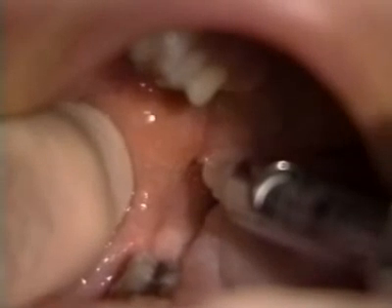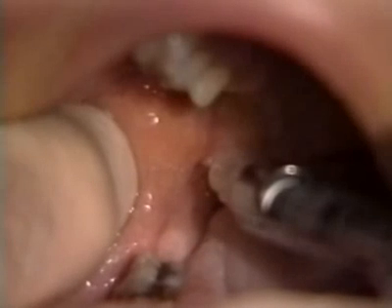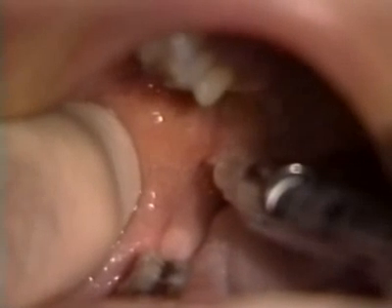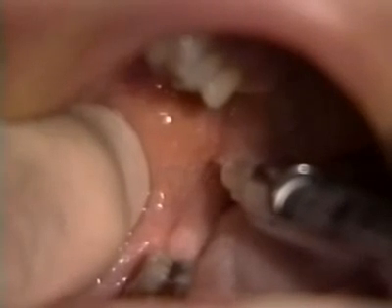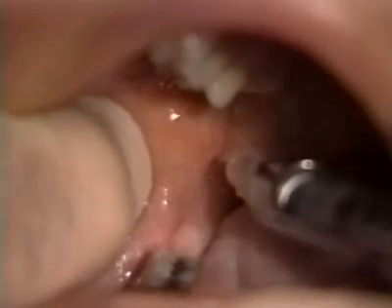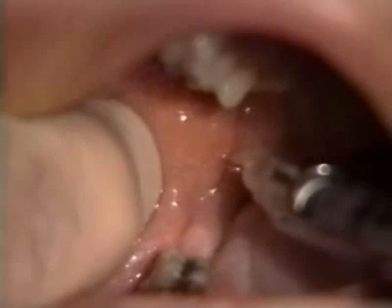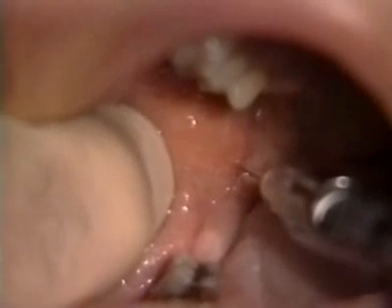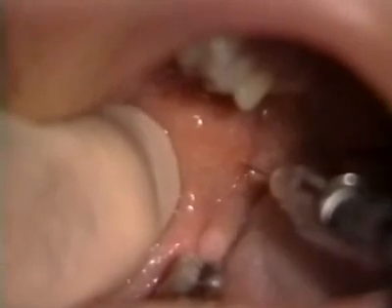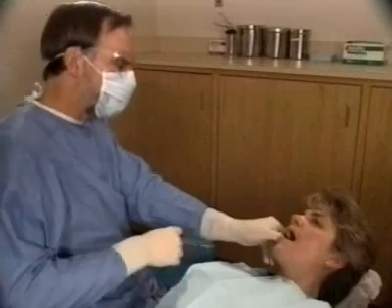test is performed. After a negative aspiration, approximately 2/3 of the cartridge is injected at a rate not to exceed 1 cartridge per minute. If lingual nerve anesthesia is desired, it can be easily achieved by withdrawing the needle halfway and depositing the remaining third of the cartridge after a second negative aspiration test. The needle is then removed, and the patient is allowed to rest for the 3 to 5 minutes it normally takes for anesthesia to develop.